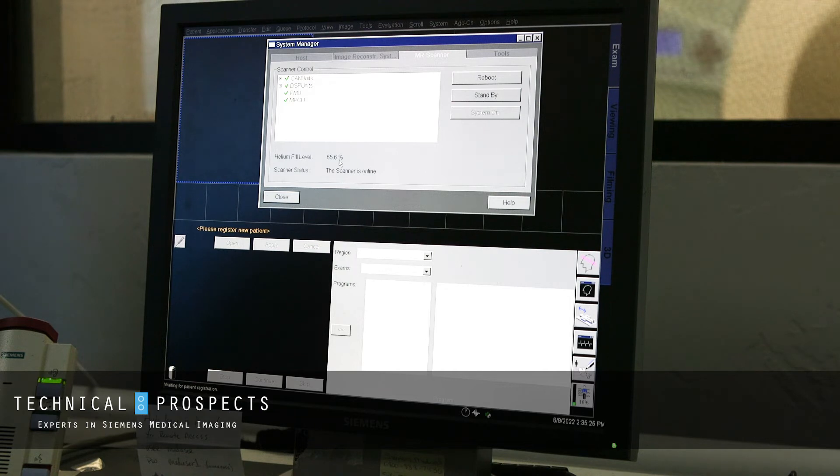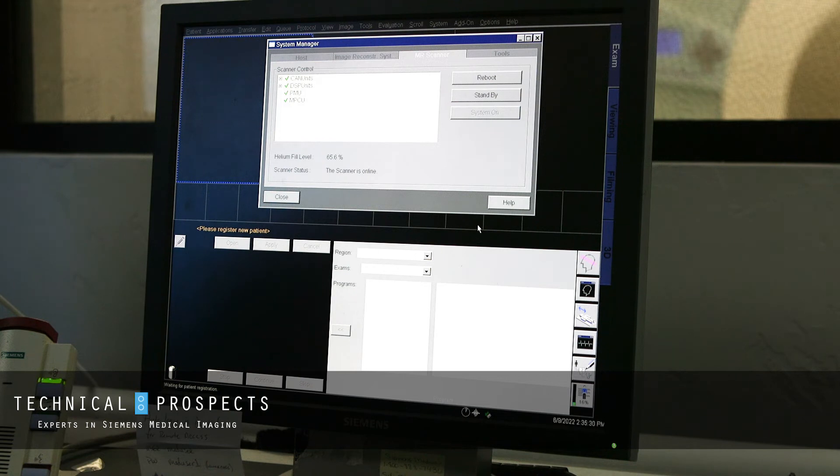This magnet is presently at 65.6%. And that is Tech Tips finding helium fill levels. And for more tech tips like these, go to technicalprospects.com and click on that resources tab.